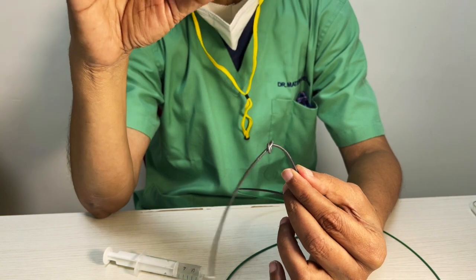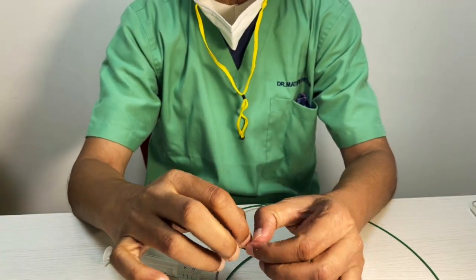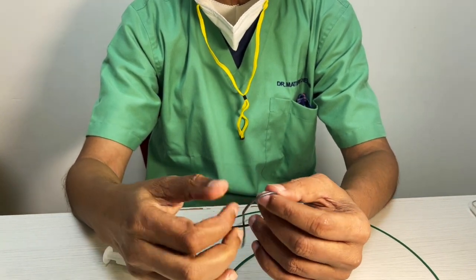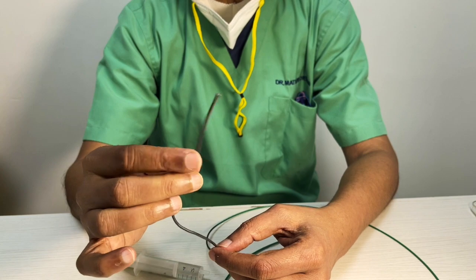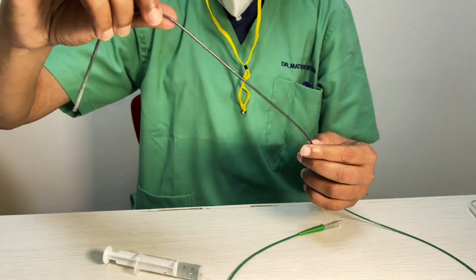Okay, so this is because of this nitinol platform. The catch is nitinol makes it a little softer. Will it really track? But we know that today they track over the 2.7 microcatheters. So along with that, if you're taking a good 2.7 microcatheter, this will work well. They say it has 12 transitions actually.